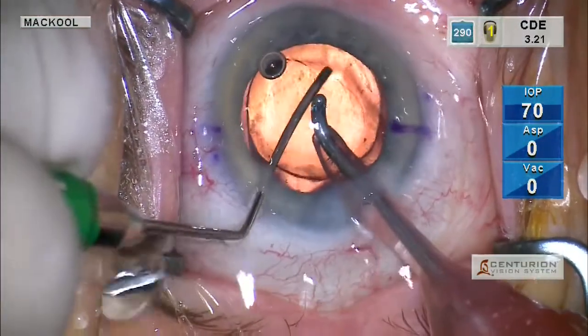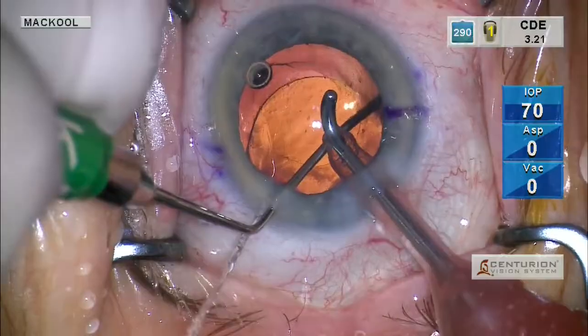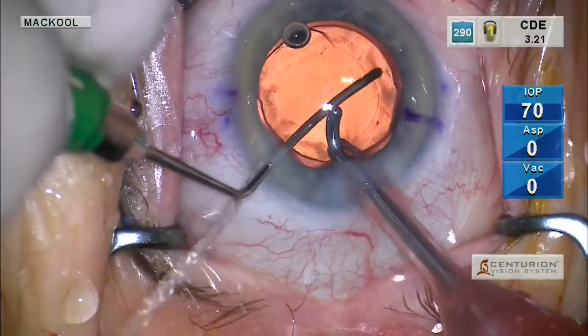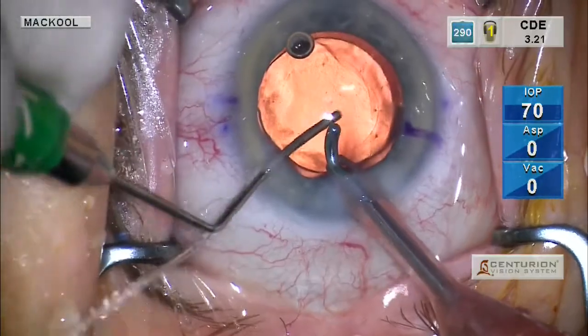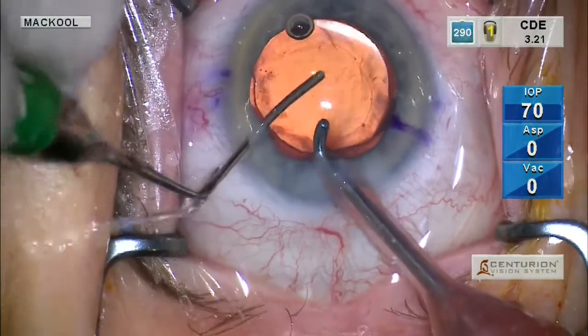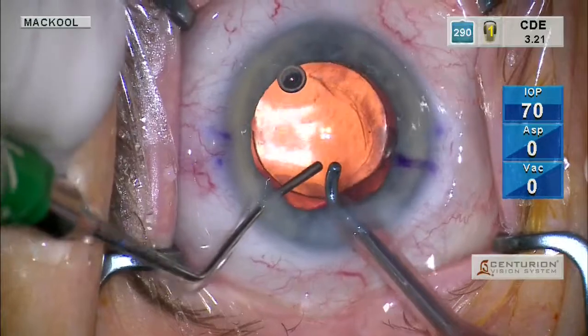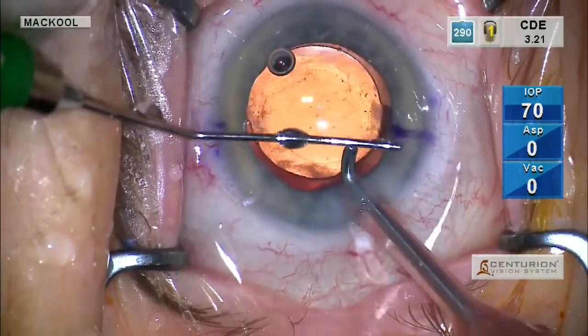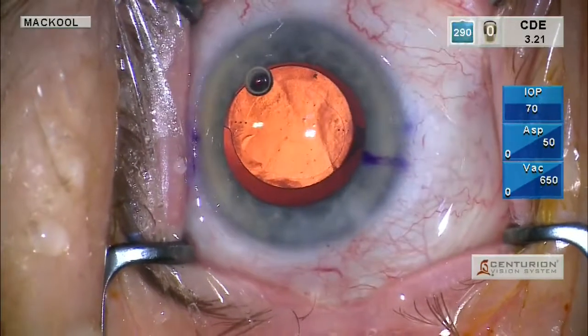And we'll also put in some myostat to lower IOP for the next 24 hours or so. So now I've lined up the toric IOL parallel to the corneal marks, as you could see there. It's a slightly nasal position, so it's parallel to the marks.